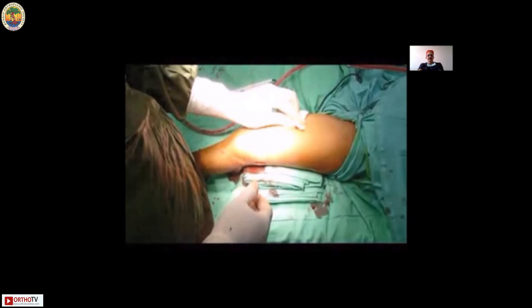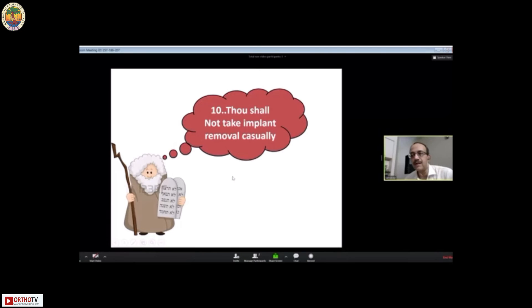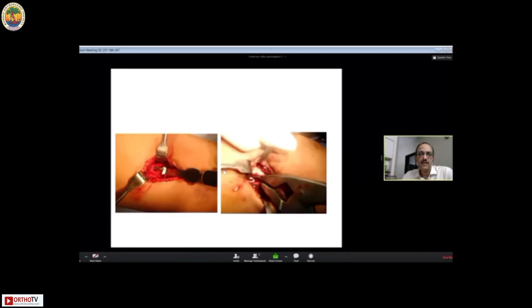In three months the fracture usually heals, and nail removal is done between six to nine months, preferably in the next school vacation. During removal, I prefer to pass a small hollow mill around the tip of the nail, bend it acutely to 90 degrees, then use a plier and back-hammer it so that it comes out easily — otherwise with time it does get stuck and removal can be a bigger issue than insertion. Remove the implant in the femur after six months, preferably within 18 months; forearm fractures can be removed later as they take longer.